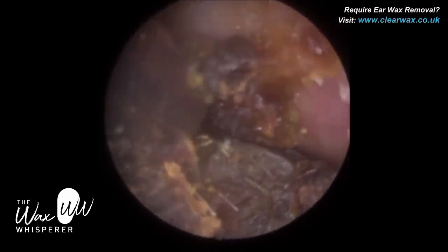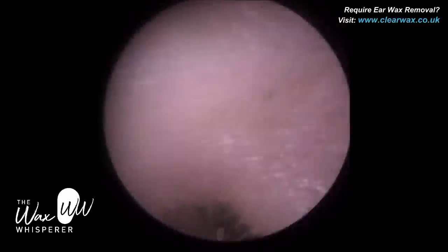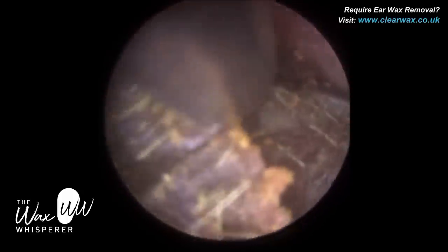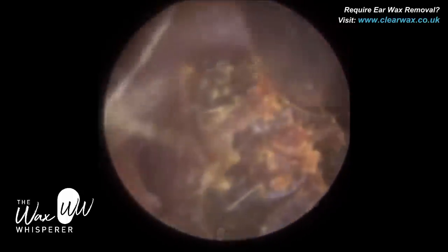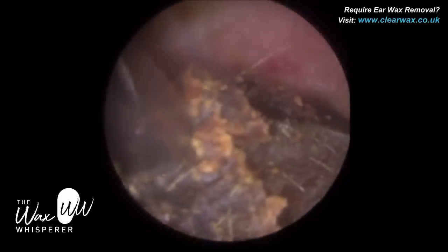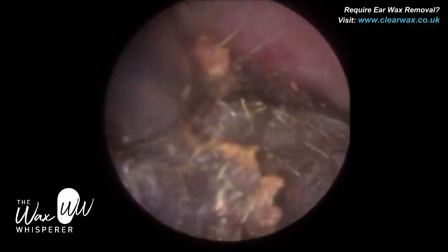So we're just in the left ear now, making good progress — we're just halfway into the ear canal. But the wax is very impacted and the consistency is a soft clay, which is probably one of the worst consistencies. There's no single micro-instrument that's really suitable for it: suction is hard to grip because it's impacted and can clog the probe; an ear hook or jobson horn just slices through because the consistency is too soft; and you can't use forceps, which will just dissect it.